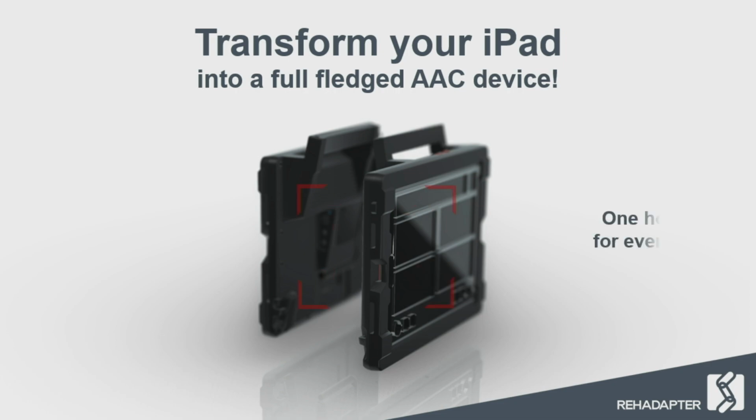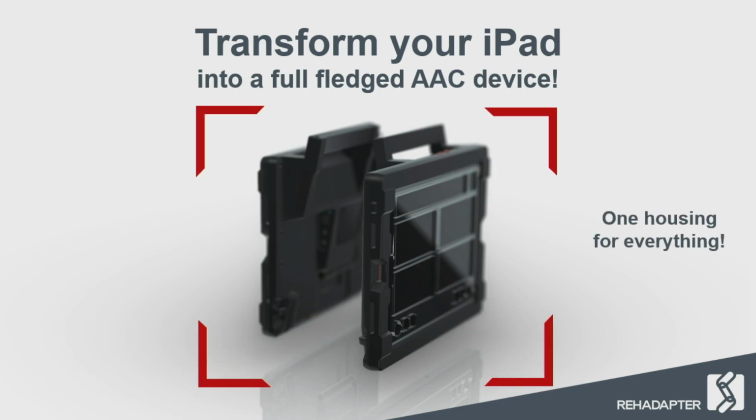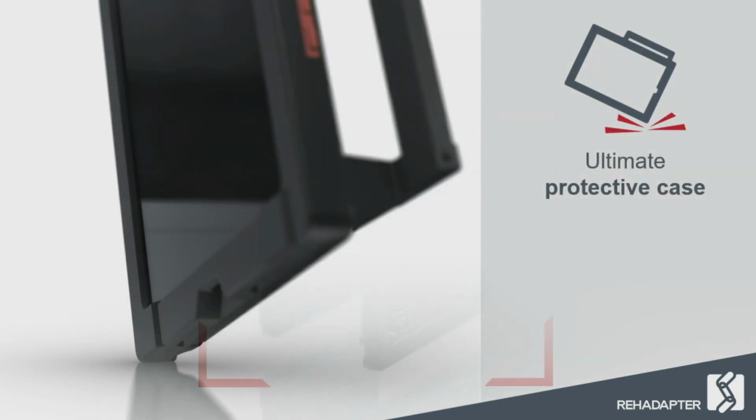First of all, we have developed one housing that supports various kinds of iPad models from a size of a 10.2 iPad, up to the 10.9 iPad. We support the iPad Air and also the Pro 11.